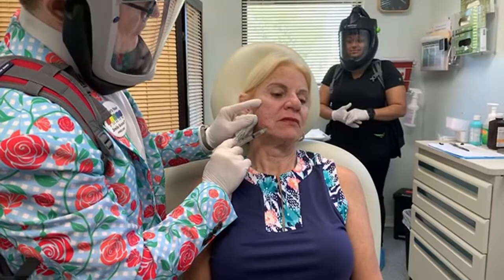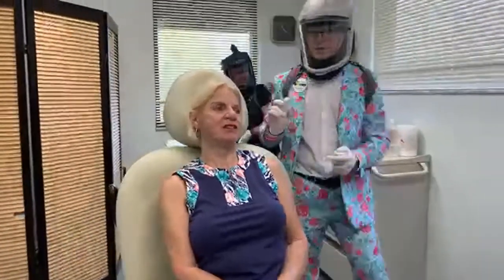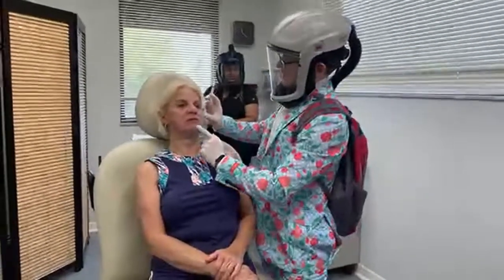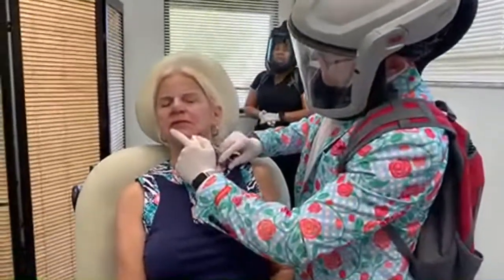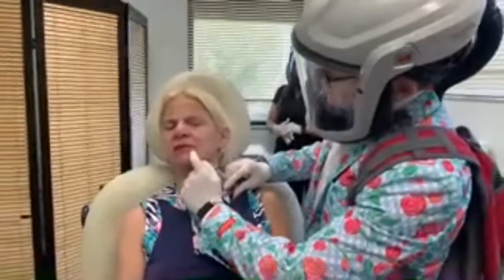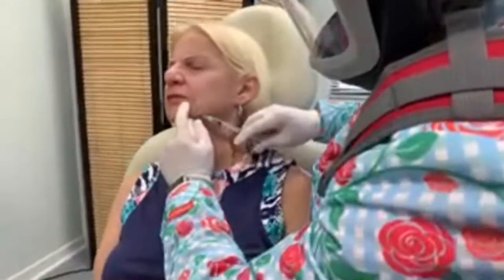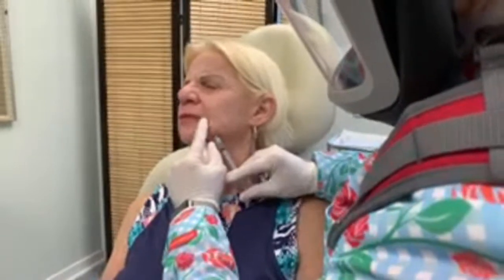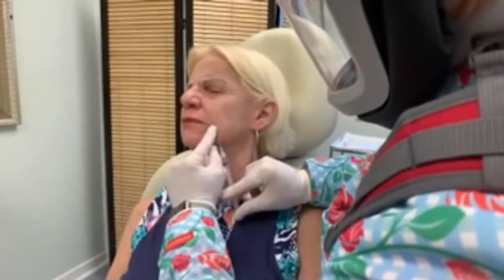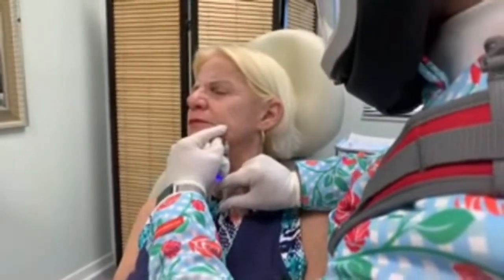So a little bit of numbing. Do you feel small, medium, big pinch there? Not too bad? Okay, so the numbing medicine first. I've never been numbed for injections ever. Yeah, it's definitely an easier way to do it, I think. Let me turn your head this way. You'll buzz and then pinch. 1, 2, 3. Pinch, little pinch there. Sorry. Usually we will have a little bit more sun damage on the left than on the right because when we're driving, we get more sun exposure from the driver's side of the window. Pinching. So we'll go slowly, and she's going to feel it get a lot more numb there. Everything's looking good.